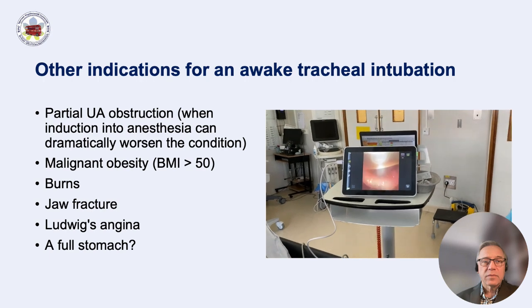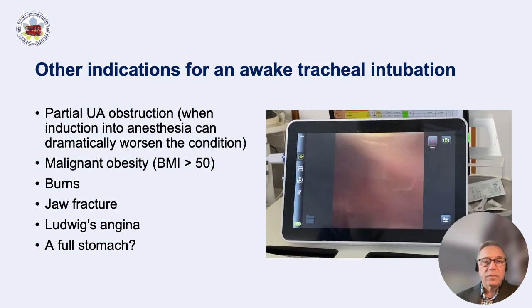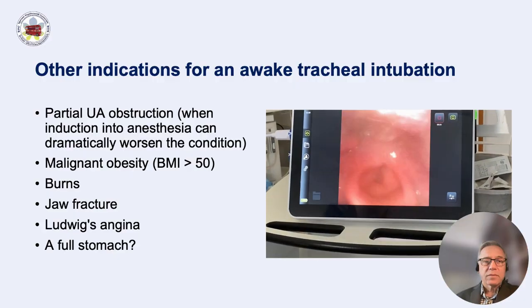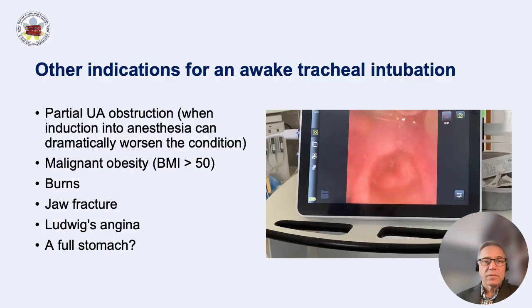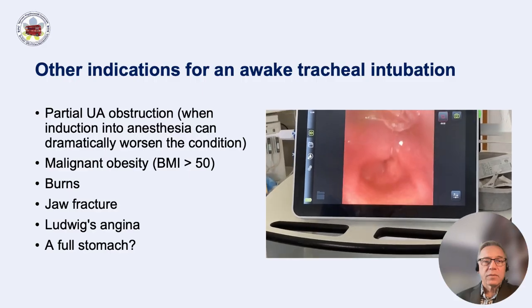Can you swallow for me? Lovely. Okay. Not a lot of runs there. Say E.